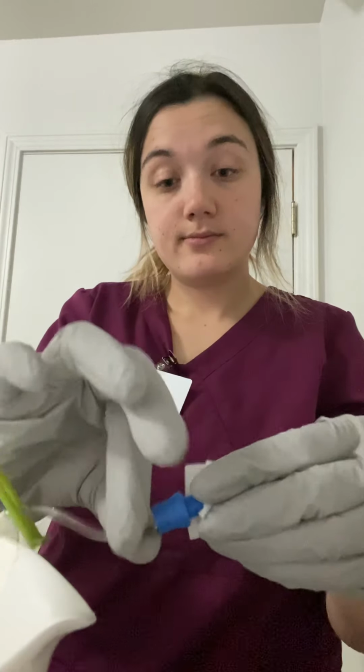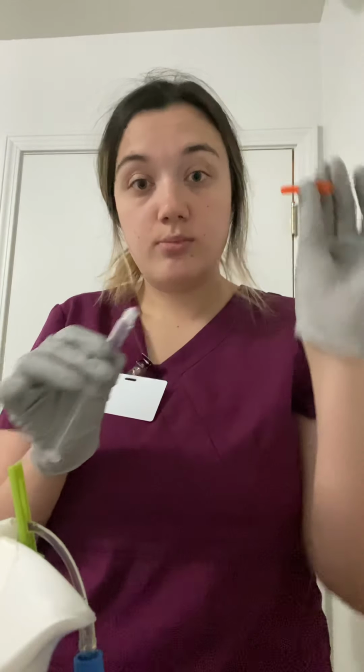So I'm going to scrub that hub for 15 to 20 seconds again.